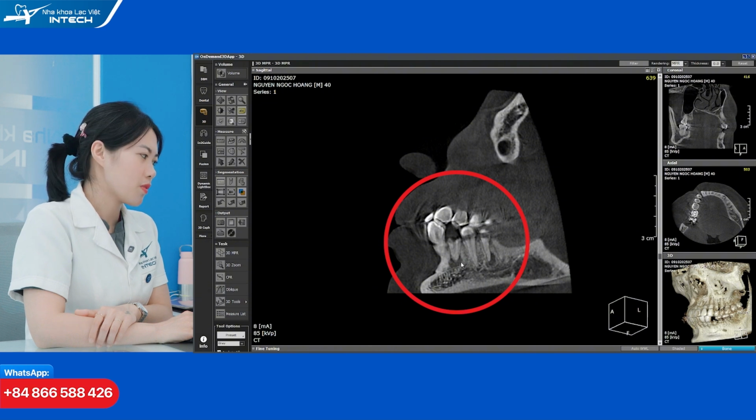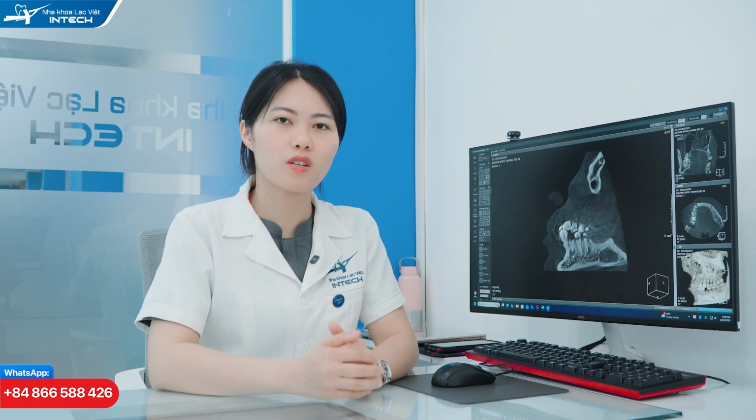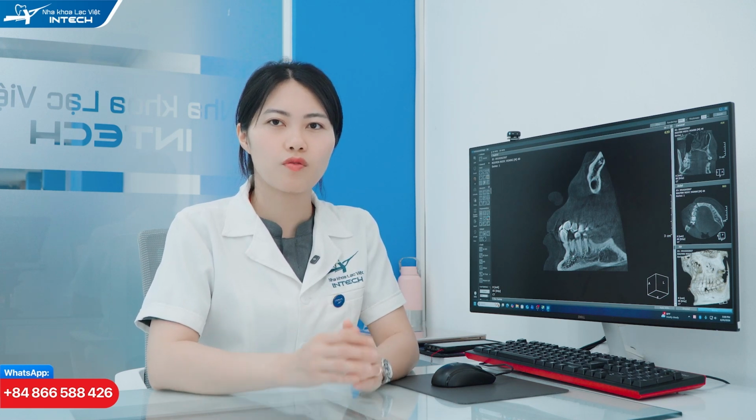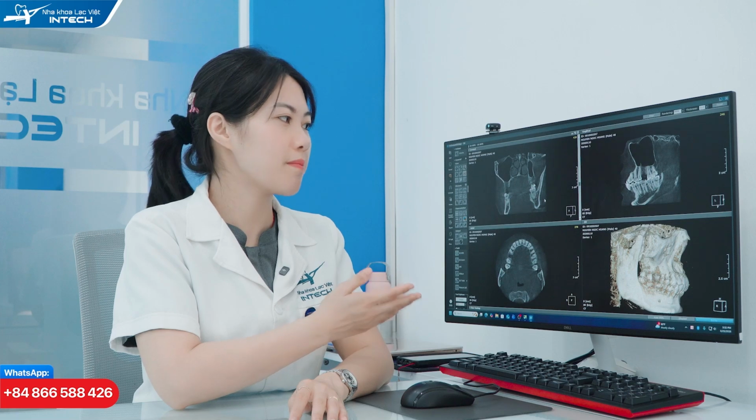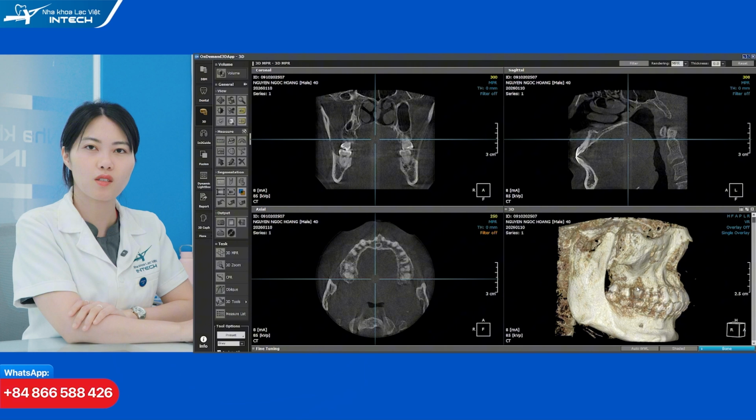If we perform immediate implant placement at this site and at the 1-6 site, there is a higher risk for implant failure. So what we do is that initially we perform extraction and thorough debridement to facilitate healing and bone regeneration. After a 3-month healing period, the sites were re-evaluated before proceeding with implant placement. This is a CBCT taken 3 months after the extraction. You can see that after 3 months, the bone has healed well.